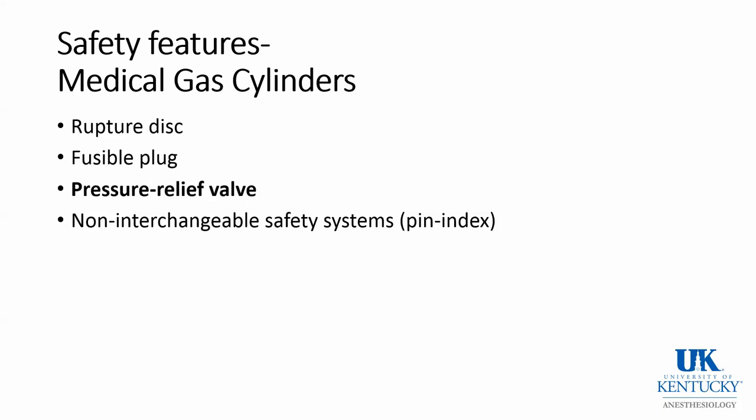The next slide refers to the pressure relief valve, which is a spring-loaded device designed to reclose and prevent discharge of cylinder contents after normal pressures have been restored. Pressure relief valves are more prone to leak, of course, than rupture discs or fusible plugs.